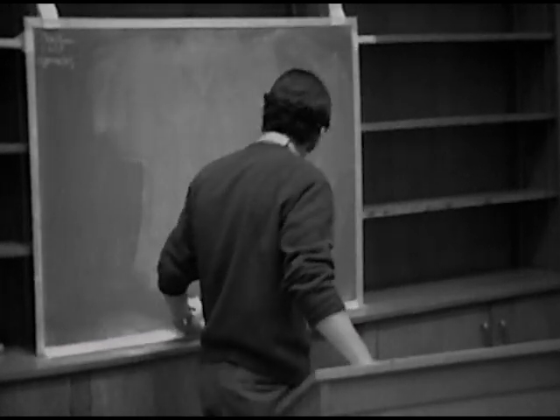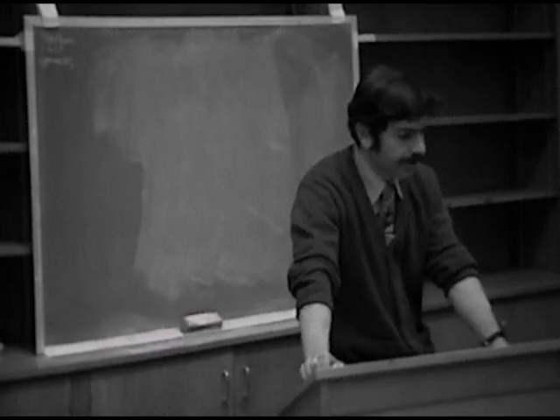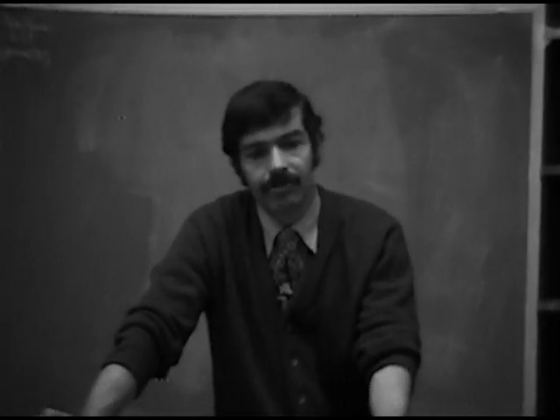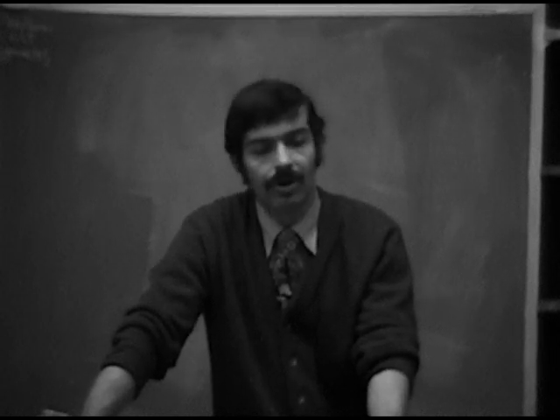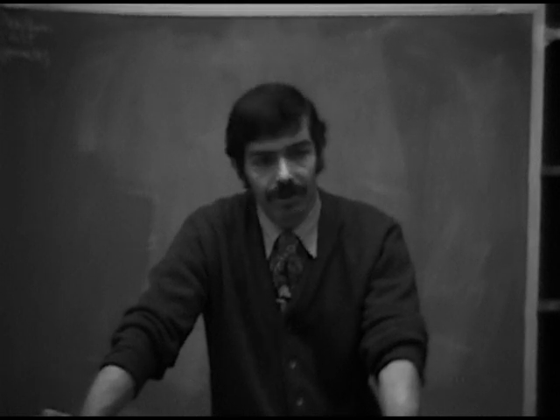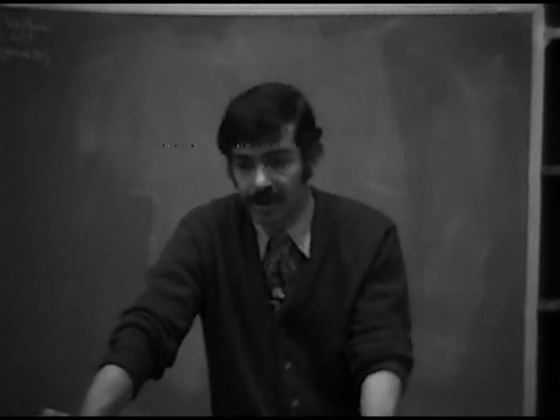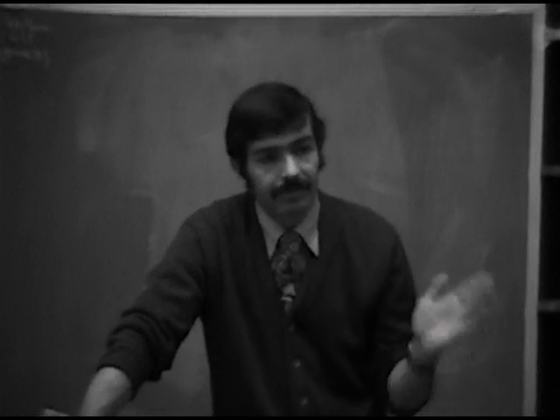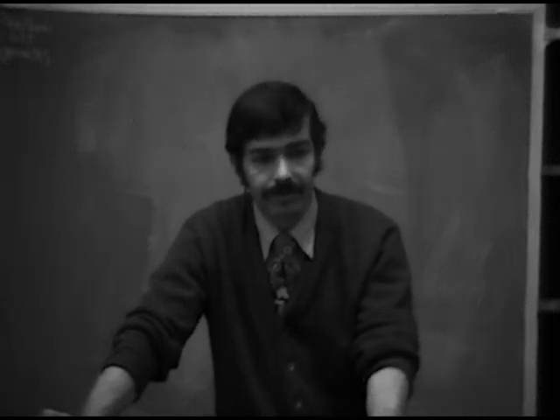Okay, so that's a little bit on ventricular arrhythmias. We just mentioned ventricular tachycardia. Of course, there are other forms of ventricular arrhythmias, such as ventricular premature beats. I think you all know how to recognize them. When they're premature ventricular beats, as we talked about, and there are ventricular escape beats. We mentioned these in the introduction to our discussion of arrhythmias. And we have your ventricular tachycardia, and then you can have ventricular fibrillation.